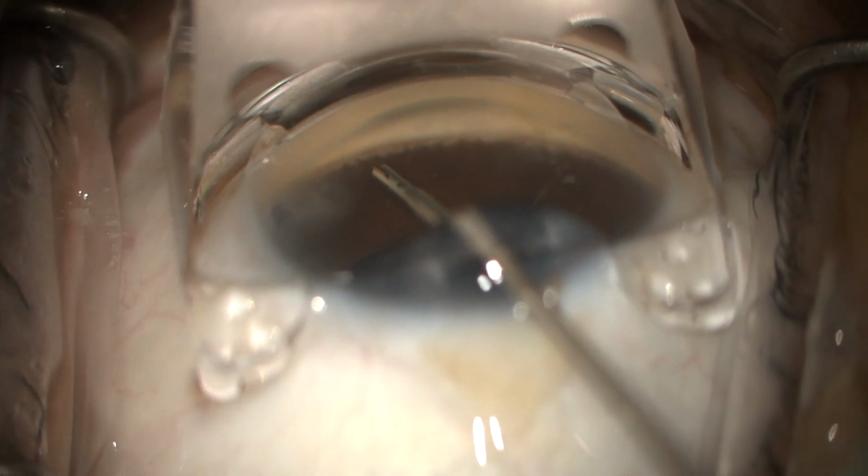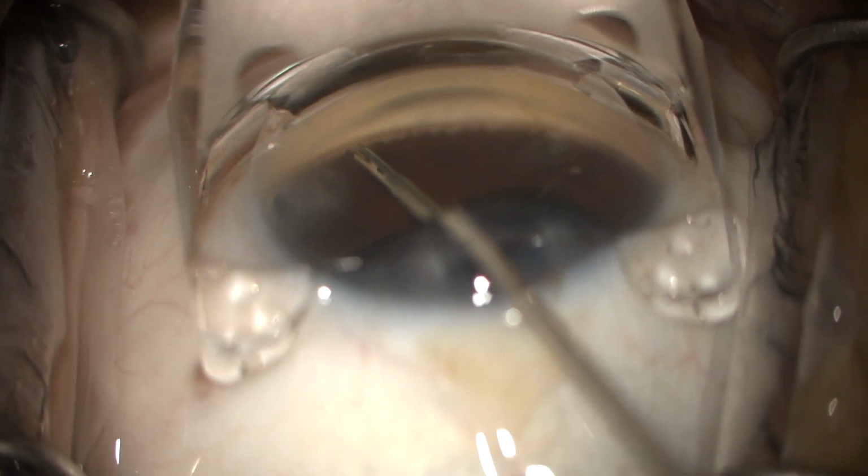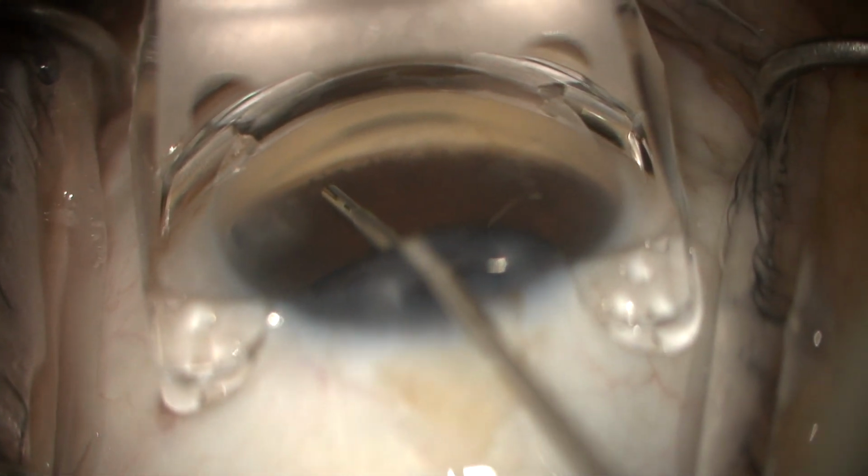We're going to enter the eye with the injector and pull back the sleeve to show the trocar. The big difference is with the old iStent you had the single V-slot window. With this one you really have a shorter window with a bridge that really optimizes visualization of both stents and also the trocar itself. It was a rounded tip with the original iStent Inject, but with the W, it's a tri-bevel trocar tip for reduced tissue tethering.